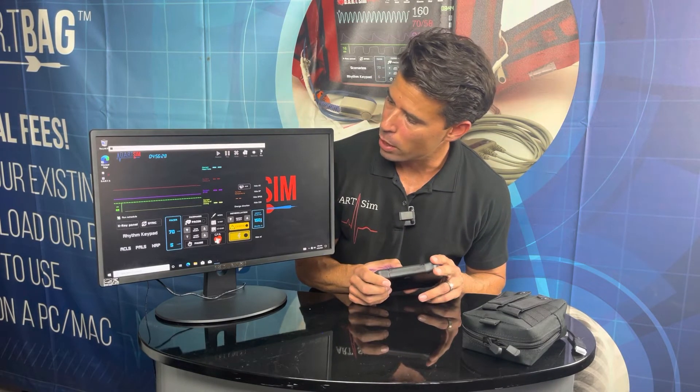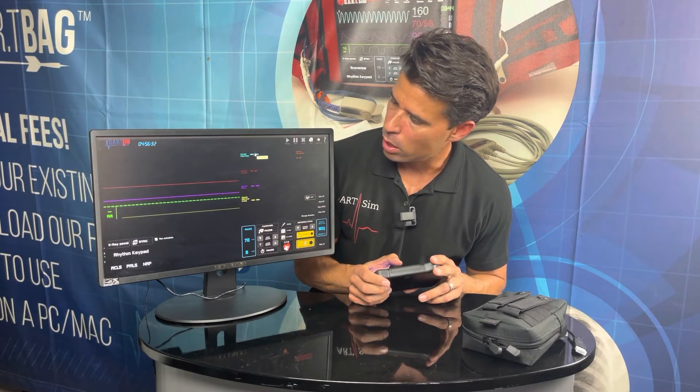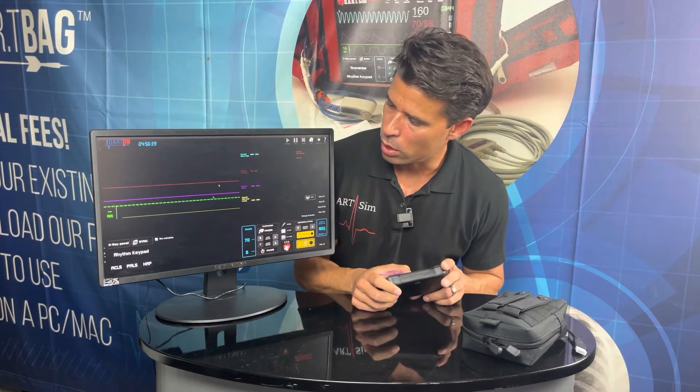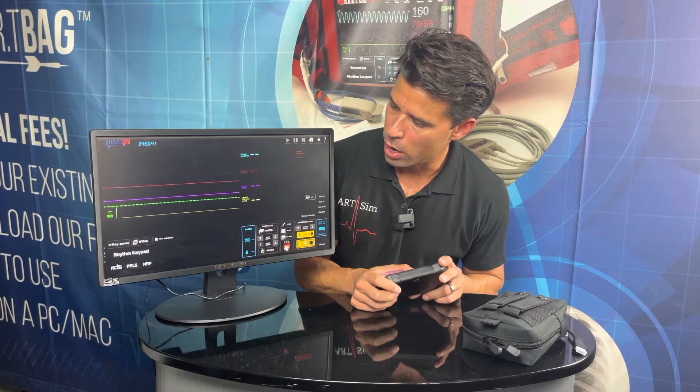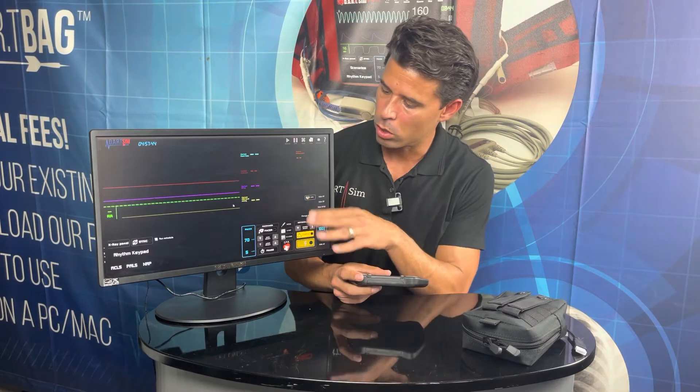Locate the maximize button and you can see it looks very nice — full screen. Then you can go over to your ACLS, choose your scenarios, or create your own scenarios as well.